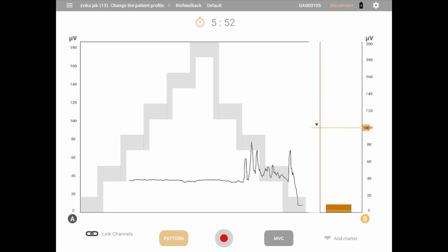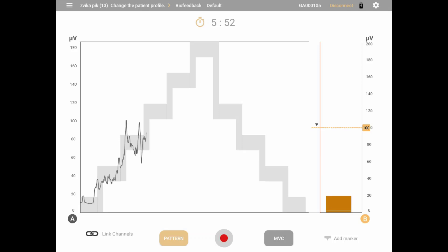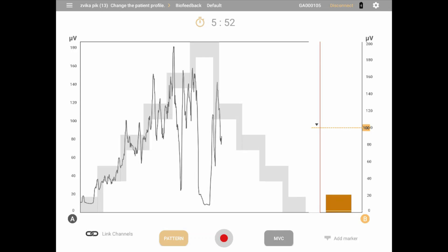Notice there is no auto scaling in pattern view. View types can be changed before and during a session; however, pattern view is a unique case. If a session is started in pattern view, you will not be able to switch to other views mid-session, and vice versa, you may not switch into pattern view from other views mid-session. Pattern view may also only be used as an open session without work and rest modes and may not be auto scaled.